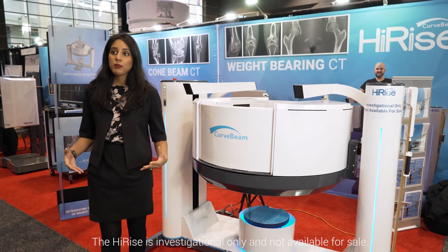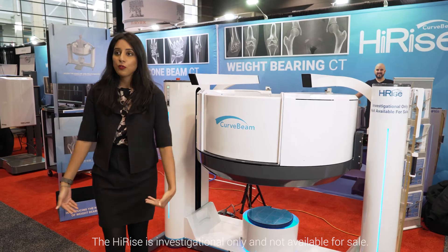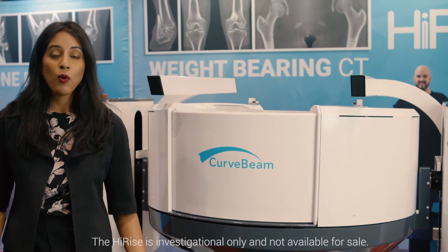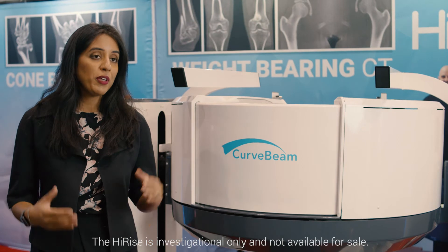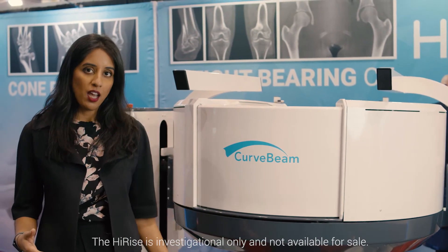There are also protocols available so if you need hip and knee, or knee and foot, or any other two or more points along the leg, you'll be able to capture that with the gantry as it moves up and down.